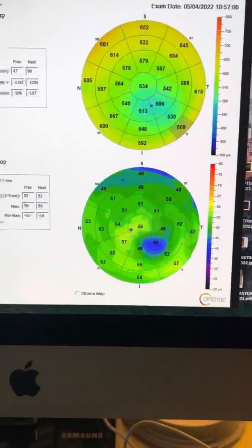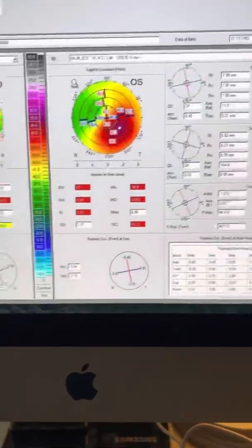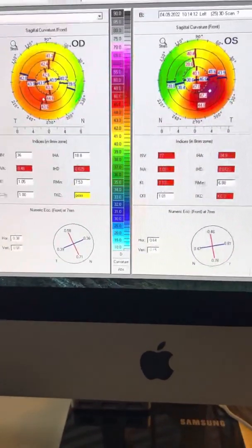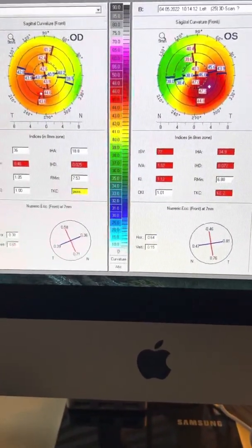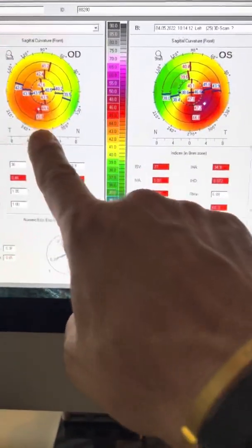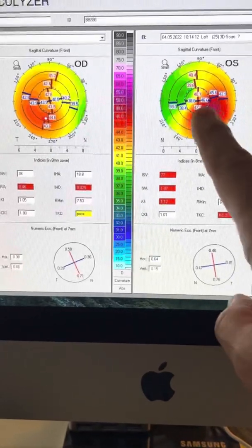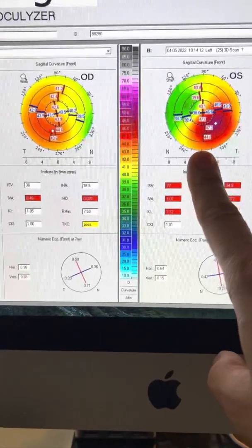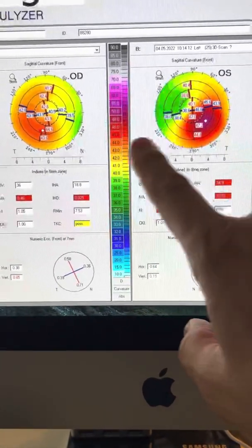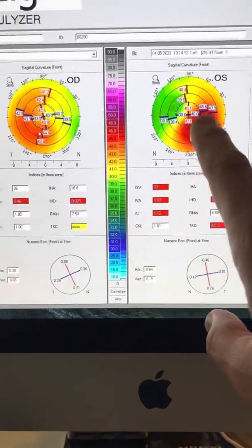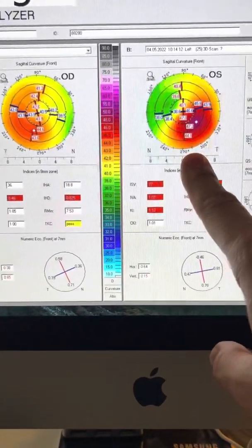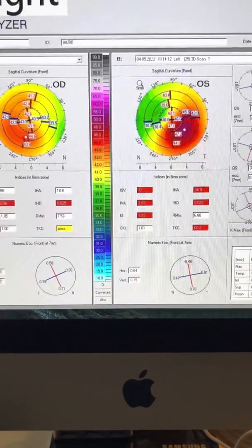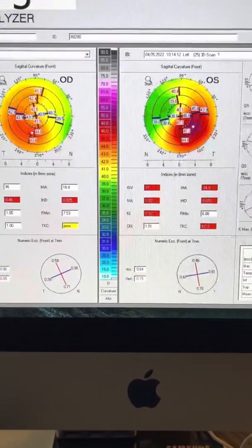And in essence, we're seeing how we can use epithelium maps as the ultimate tool to read and assess tomography maps by corneal tomography or the Pentacams. And the slight steepening on topography does not necessarily mean that the keratoconus has gotten worse. Very important points.